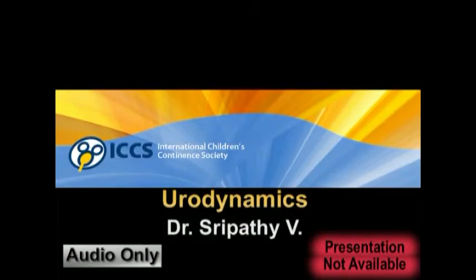Now, this is the ICCS stand on Uroflow plus EMG. If available, the addition of pelvic floor EMG adds to the value of Uroflow in children, and EMG at best gives only an estimate of urethral function in children. We are talking about Uroflow, we are talking about EMG being done with patch electrodes, not with needle electrodes. So the methodology: children are asked to drink water till their bladders are full.